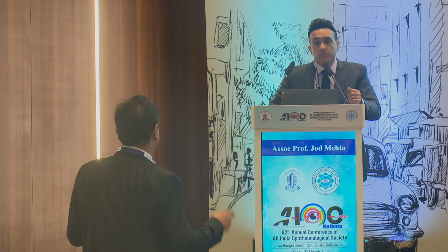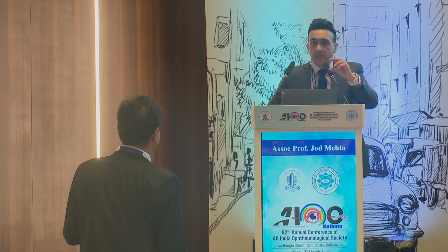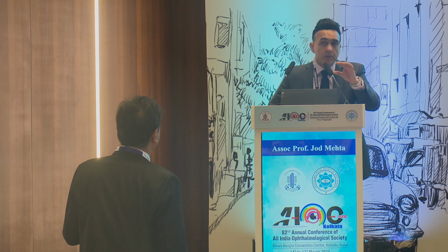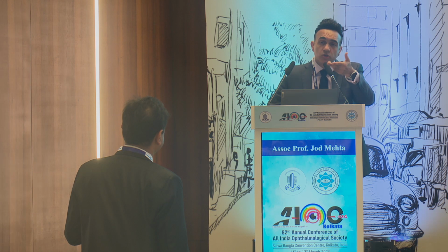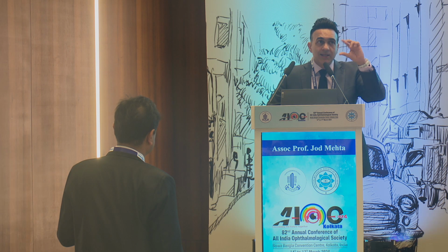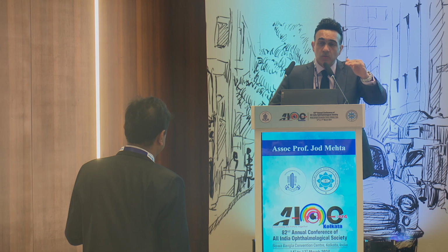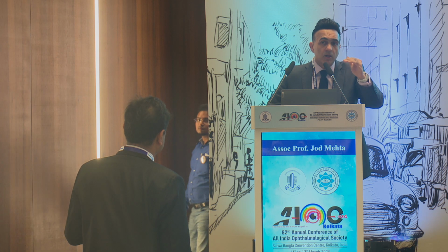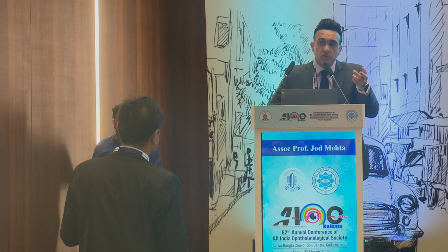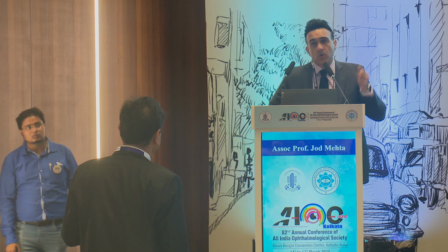So the parameters have to be taken from that. Yeah, you can take that, but your pocket was probably about 150 as well, right? Yeah, correct. So you can do OCT to give you some idea, and the Circle software allows you to have a 10 micron side above and below. So I'd aim for 150, and you're going to get very close to the level of the interface. I'd make the pocket into a flap, and then start with the haze treatment from there.